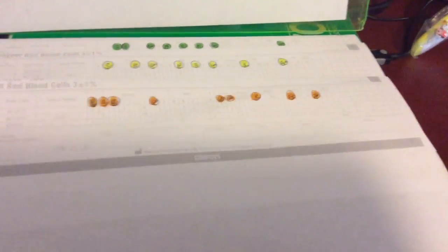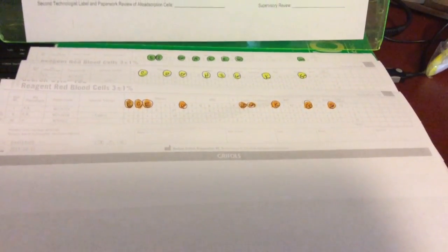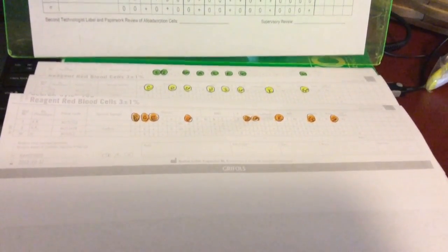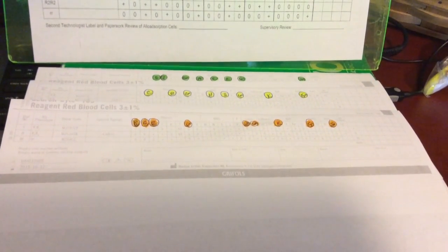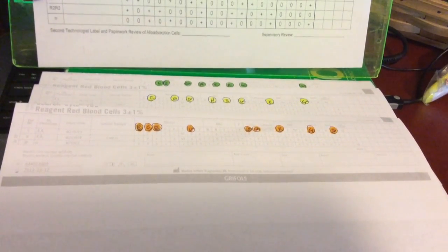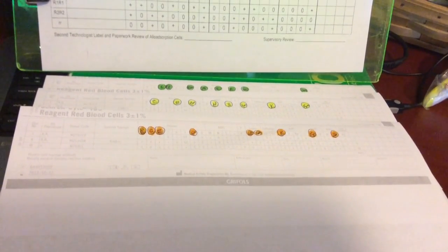So you have set up a modified rule out to match your modified serum. So once you have your 3 serums, you have a new rule out for every single serum. Together, and I think you can see it here, I said they line up. Together, if they were all non-reactive, it would be pulling out that autoantibody and determining if there's any underlying alloantibodies.